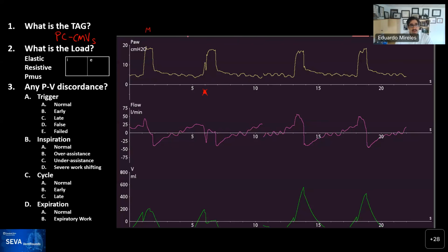Rob, talk to us. One thing to point out is that this ventilator mode is called PC plus, and you'll say, well, what does the plus mean? Well, it means in this case, I believe, that you have an active exhalation valve, which means that the patient can breathe in and out during a mandatory pressure controlled breath.